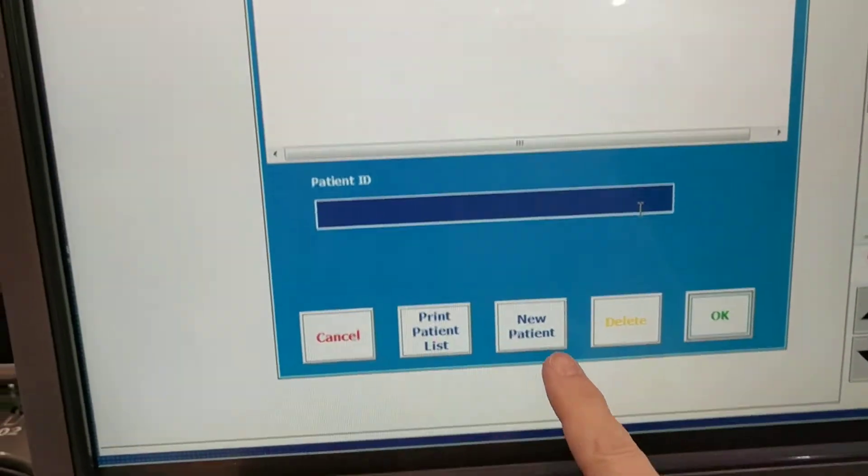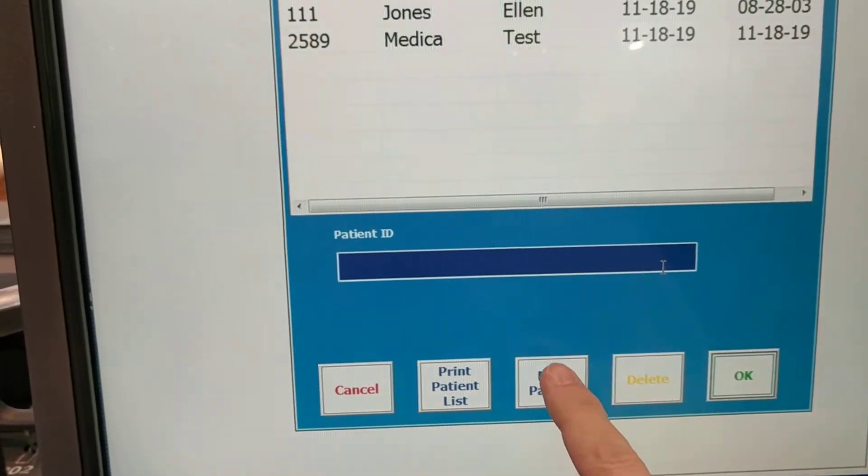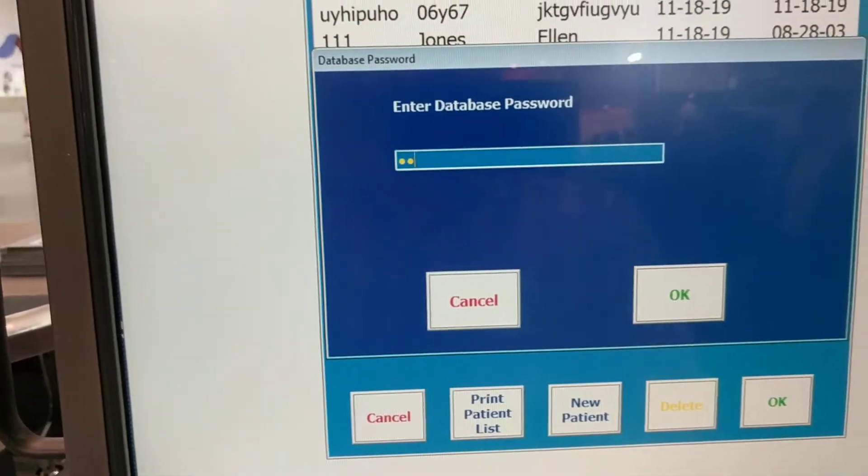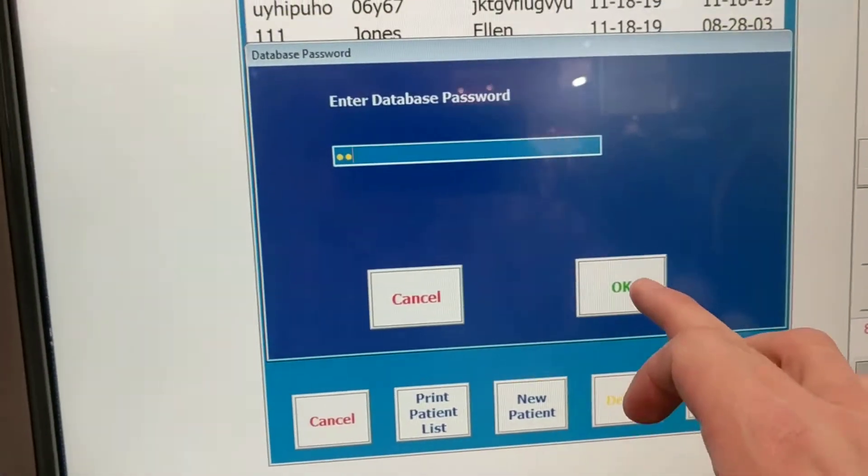Down on the bottom, you want to choose New. Re-enter that same password.